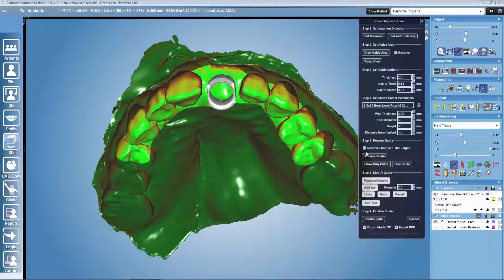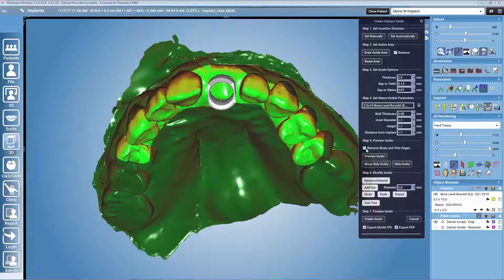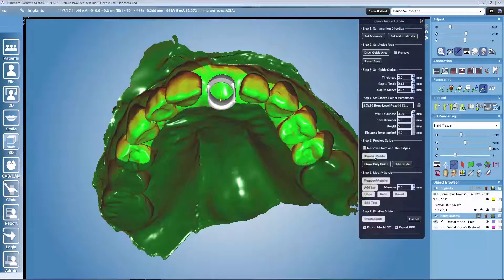After that, in step number 5, we have the possibility to select to remove sharp and thin edges. This should always be selected when doing real patient cases. After that, we can create a preview of the guide.